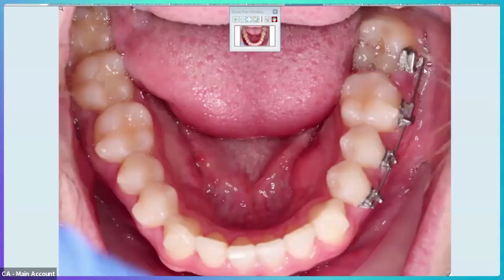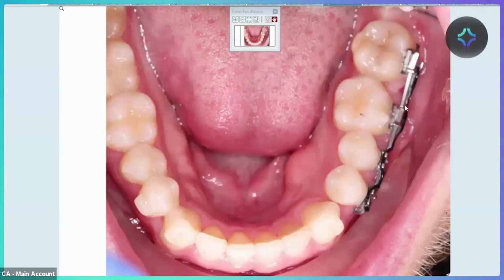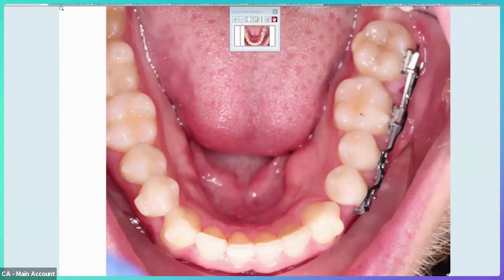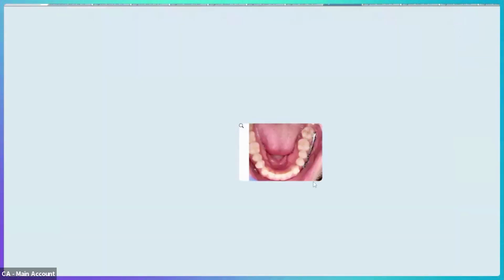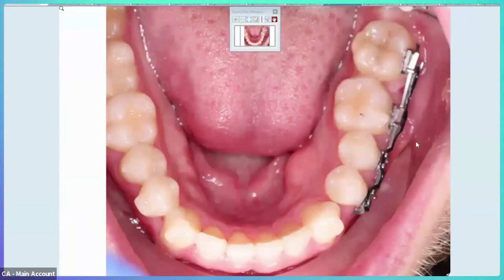We're working our way up from a light stainless or light nitinol wire, like probably a 16, 14, 16 into an 18. And then we'll go into a square wire. So that's what we do. We go ahead and put on our square wire, and this is not going to pop out at this point. Now we have a nice square wire in here. Again, it was super easy stuff. We're not doing anything too complicated. The one thing you're going to notice though, oh, and then the wire popped out again and it started spinning the tooth slightly. Go back one.